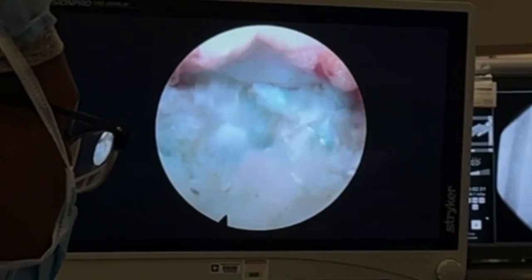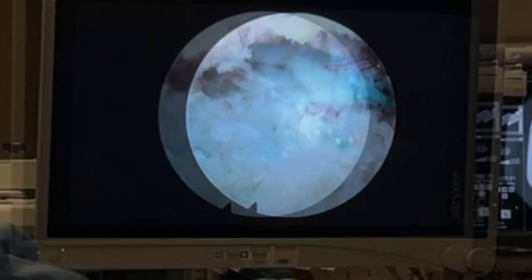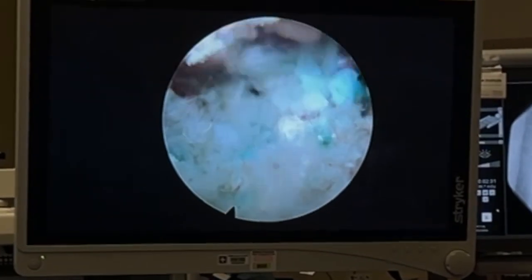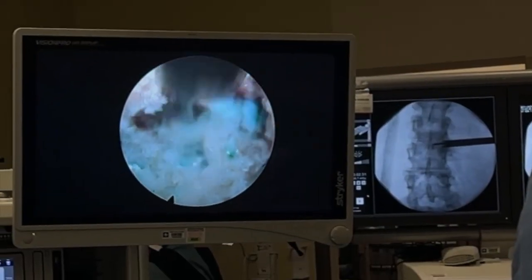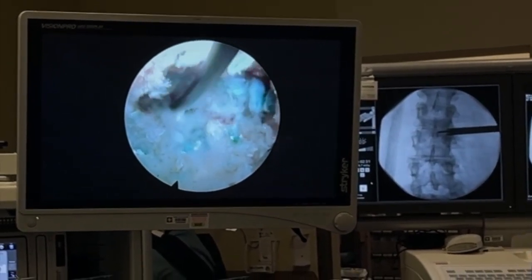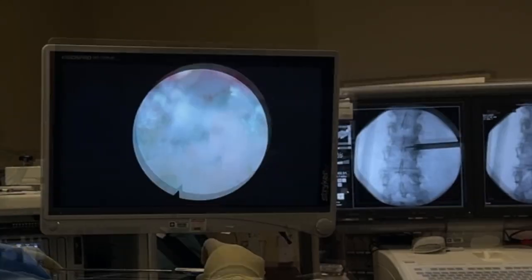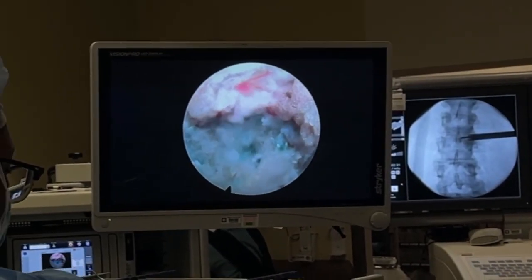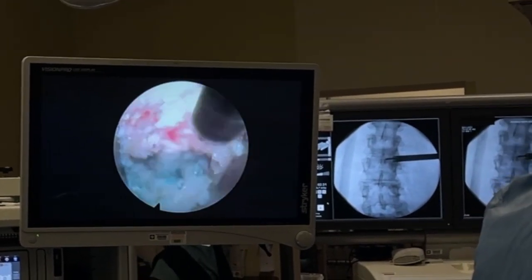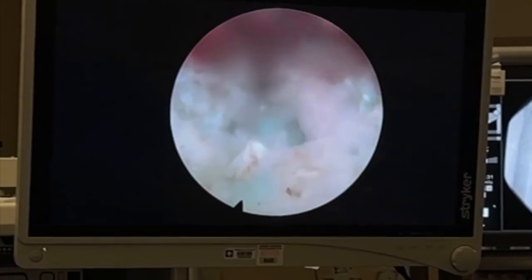I'm almost done. I just need to make sure that that dural tube is totally free and all of this was stuck to it. But not no more. Yes, I just gotta clean up that. Whoop. He just jumped when I did that, just by gently caressing the nerve, because that's what nerves do. Doesn't like being messed with. Because my mom always said spine surgery would be a lot easier without blood vessels and nerves. She was totally right.